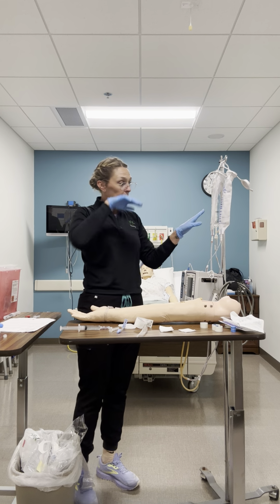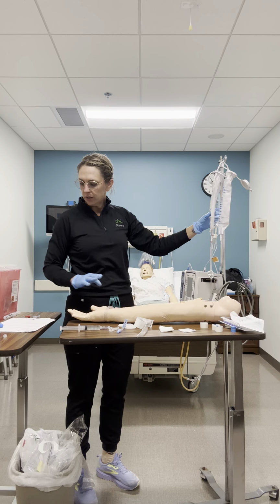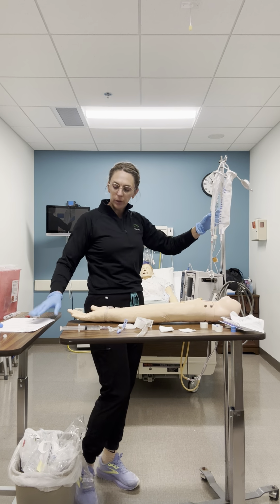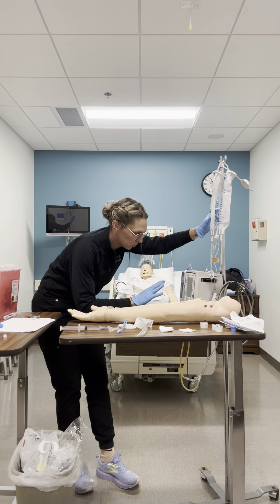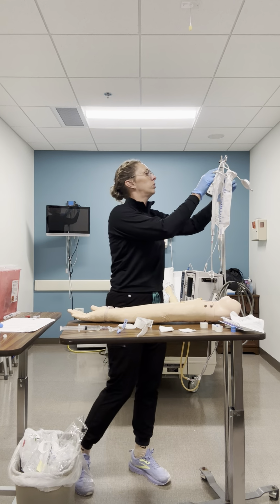Now I'm going to do my third medication check. Checking, making sure 7 rights of medication administration, everything looks good there. We're also going to be checking the pump at this point, making sure the rate matches the prescription, and it does.